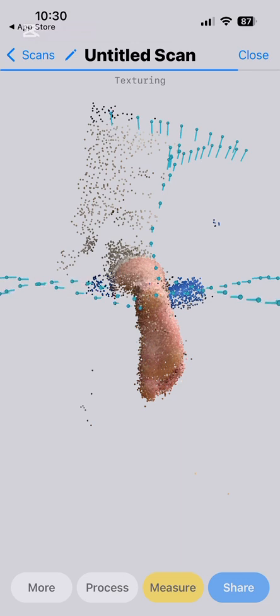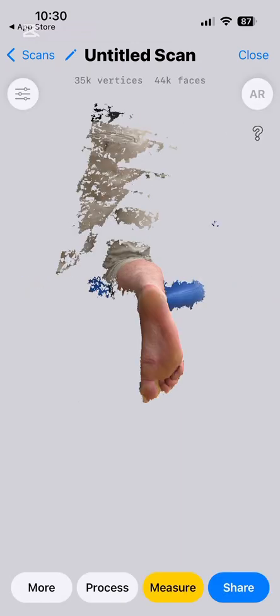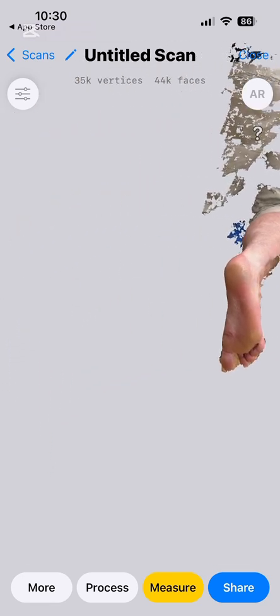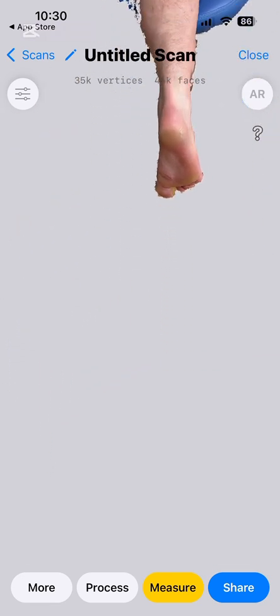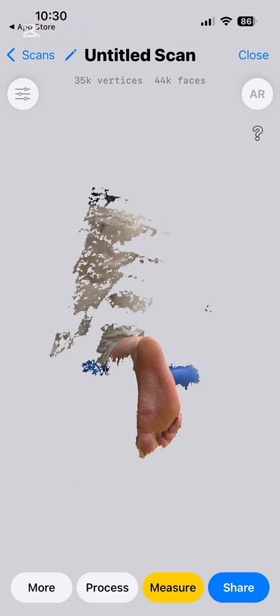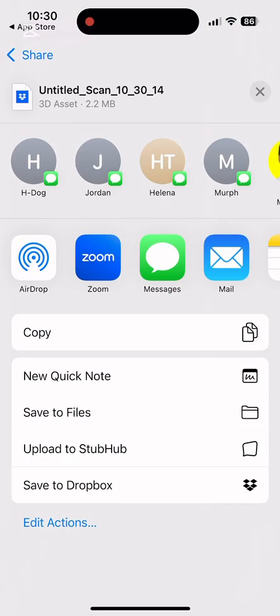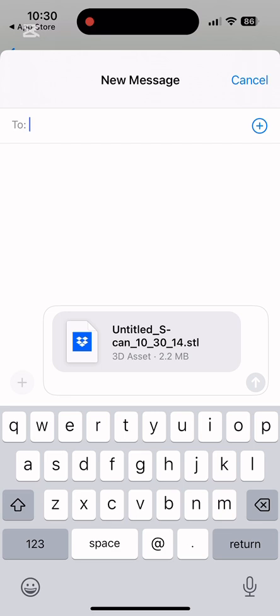Once the scan is formulated here, we can have a bit of a look around. Yep, we've got a nice complete image of the foot and it's an accurate representation. Once that happens, we can push share, and then we just want to make sure we're saving it as an STL.